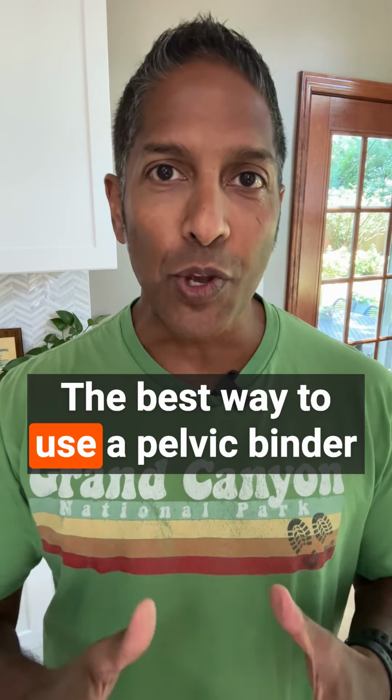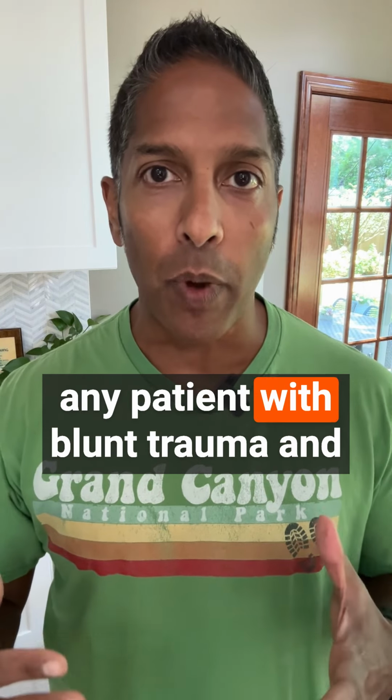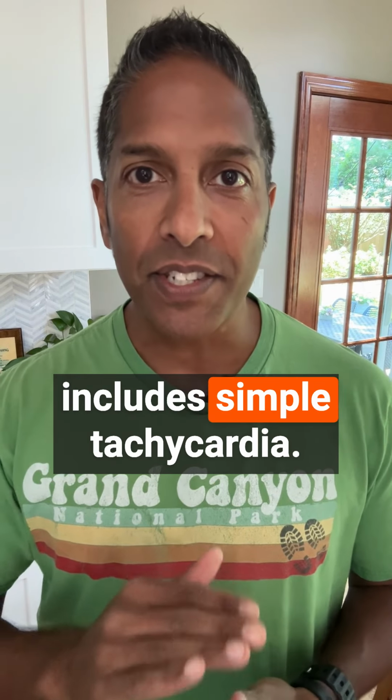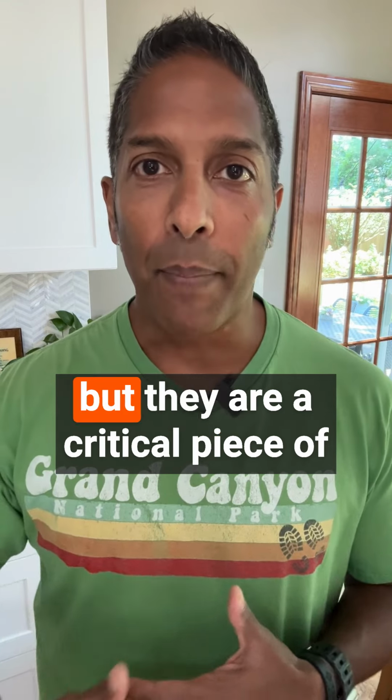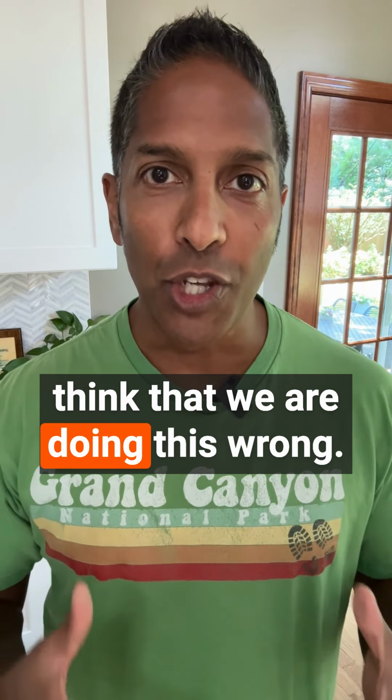The best way to use a pelvic binder is indiscriminate application to any patient with blunt trauma and hemodynamic instability, and that includes simple tachycardia. We don't spend a lot of time thinking about pelvic binders, but they are a critical piece of equipment in major trauma, and I really think that we are doing this wrong.